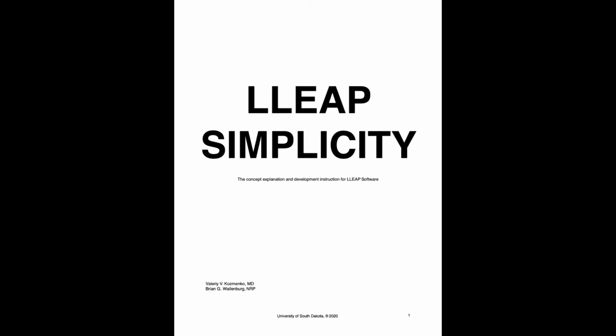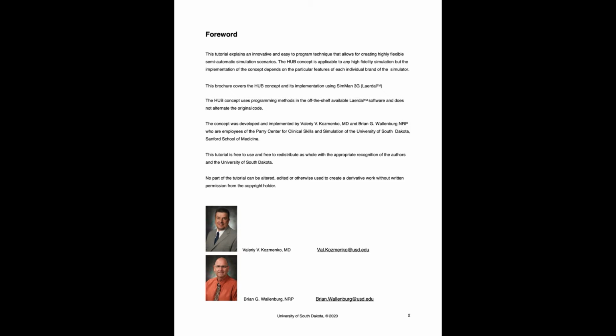The hub concept is applicable to any high-fidelity simulation, but the implementation of the concepts depends on the particular features of each individual brand of simulator. This brochure covers the hub concept and its implementation using Laerdal LLEAP software. This concept does not alter the original software code.